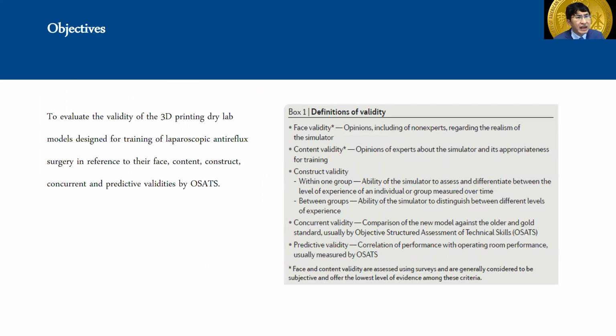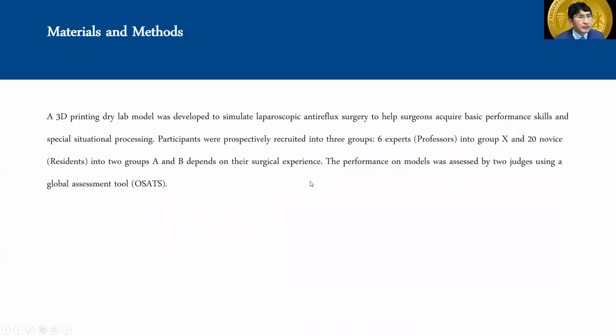So this study is to evaluate the validity of 3D printed dry models for LARS in terms of face, content, construct, concurrent, and predictive validity by OSATS. So this is a box with the definition of the validity for each part. A 3D printed dry model was designed to simulate LARS to help surgeons acquire basic skills and special situational processing.